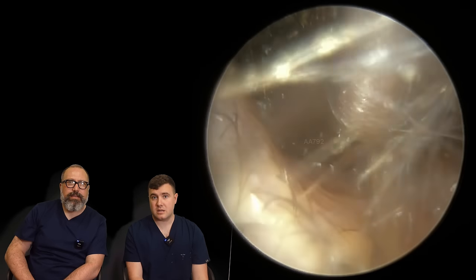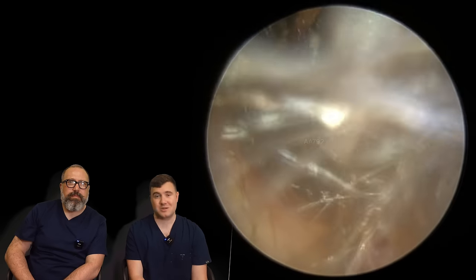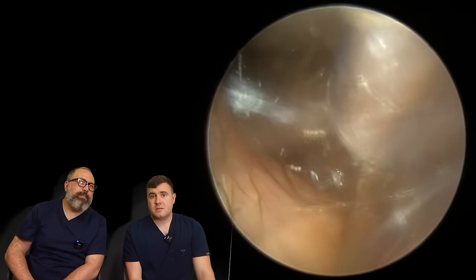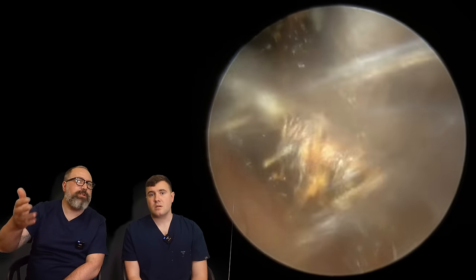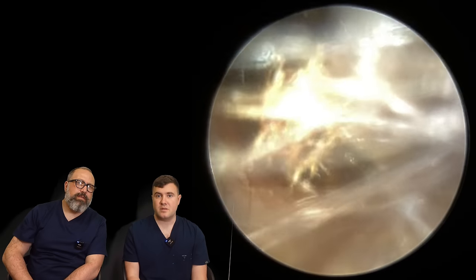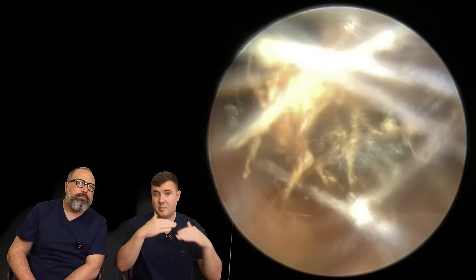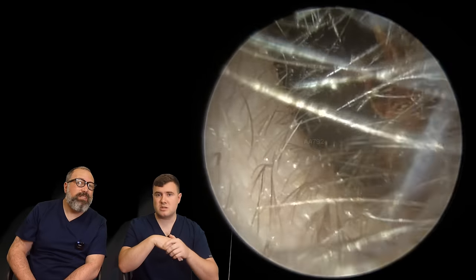I believe this patient has had wax removed in the past, but it was about 15 years ago, so quite a while. We would have recommended this patient to have more regular checkups on their ears, just to stop this from happening. What would you say is the average time, based on your experience, between appointments? If you're a wax builder like this, it's very difficult to judge, but I'd normally recommend they book in when they start feeling some issues. I generally tend to see a pattern with repeat patients — the most common is about 12 months, once every 12 months.